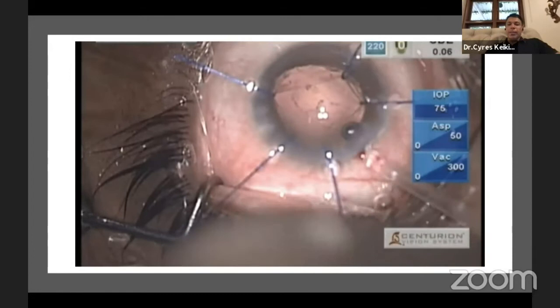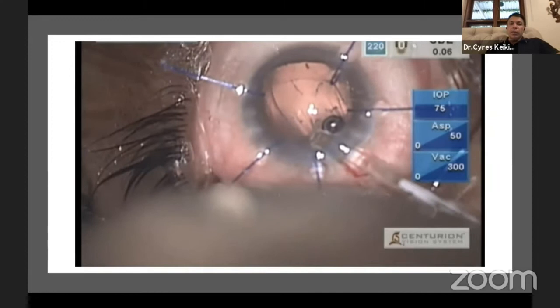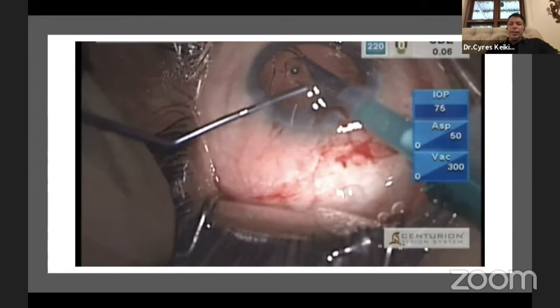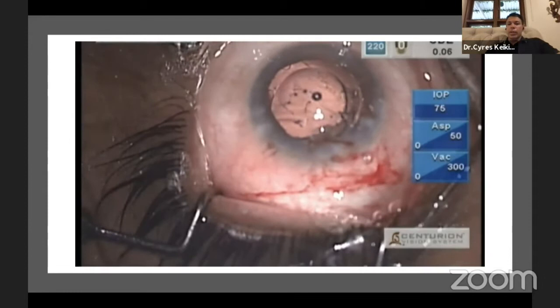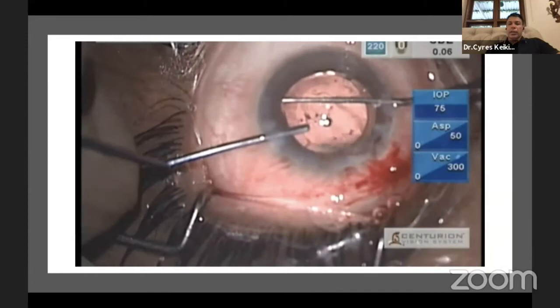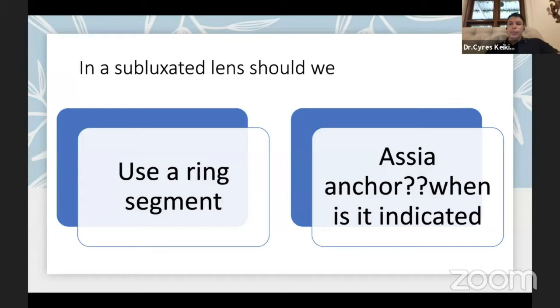Now I inject a capsular tension ring from Otech, a European company. These come pre-loaded and are not expensive — far better than the average PMMA tension ring. It goes in one shot with no maneuvering needed, and the bag is absolutely stable. I had a three-piece lens on standby in case things went wrong, but was able to use the single-piece lens the patient had chosen. The IOL is centered nicely in a stable bag-IOL complex behind the iris, and that is the end of this case.